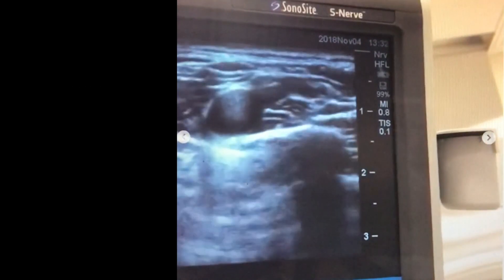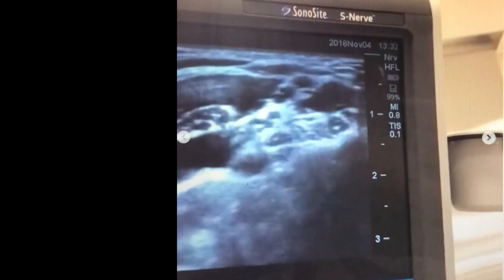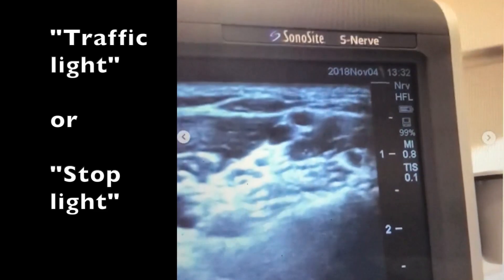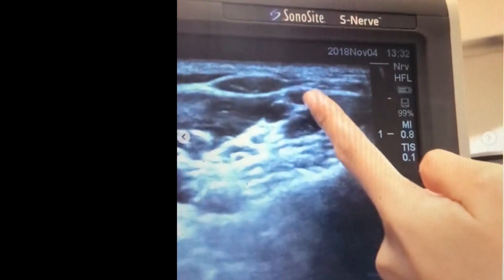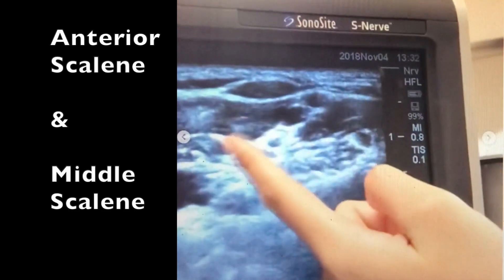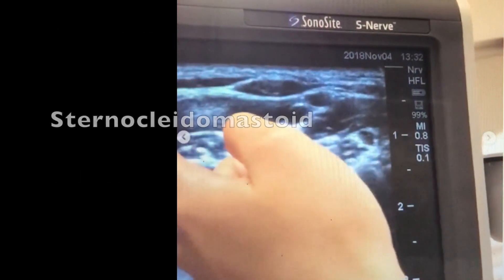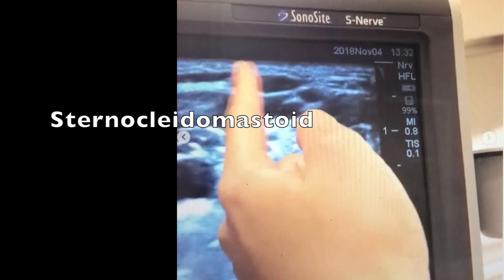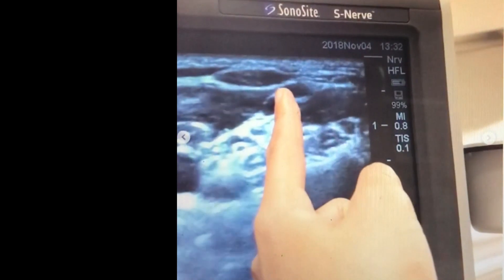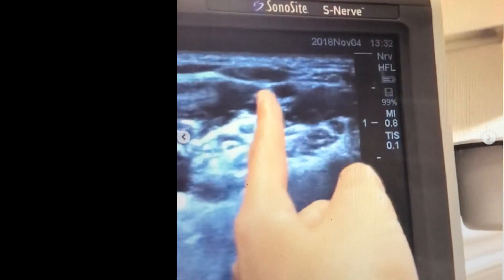As she moves the probe towards my head, you'll see the bundle of grapes start to converge. Our goal is to find a traffic light — three nerves in a line. She found it easily: one, two, three — a traffic light. To the right and left of that are the scalene muscles, and the sternocleidomastoid muscle is right here. Typically where the SCM ends, you'll see the traffic light — a good anatomical landmark in most people.